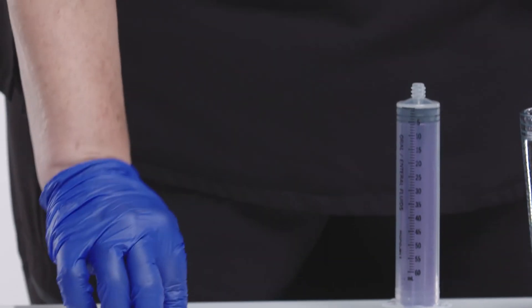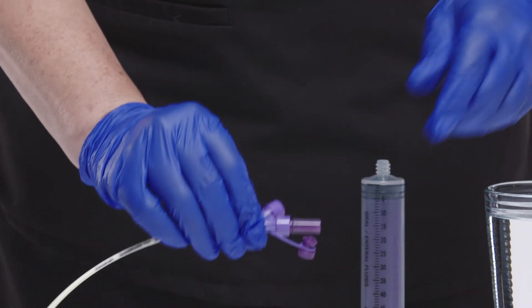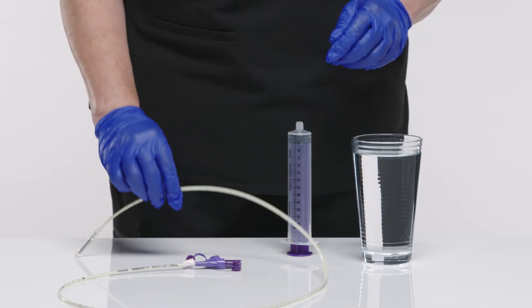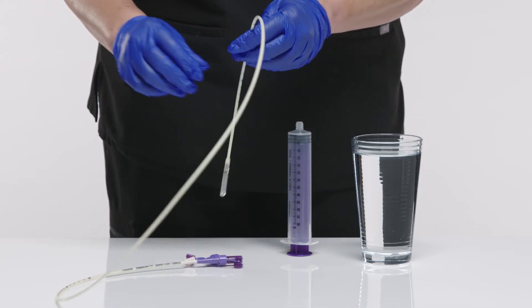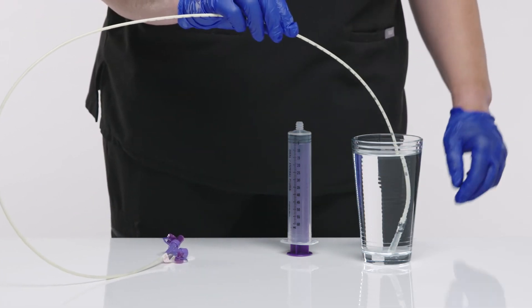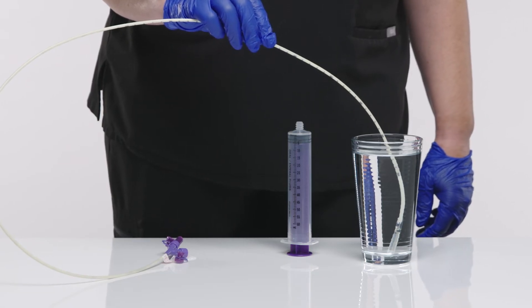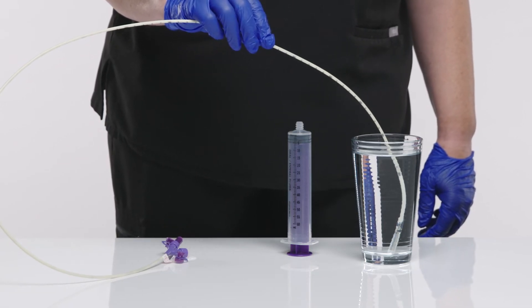To prepare the tube, secure the stylet on the feeding tube. Take care not to over-tighten the Enfit connection, as over-tightening can result in the Enfit connection cracking. Activate the hydromer coating by resting the first five inches of the distal tip in water for five to ten seconds, and place the feeding tube as per facility protocol.